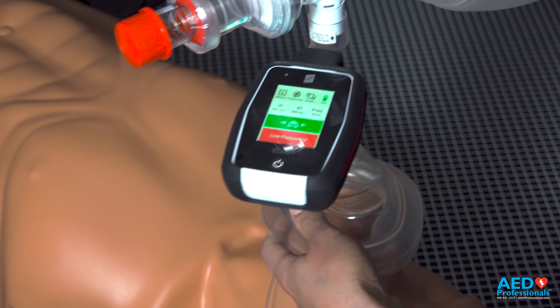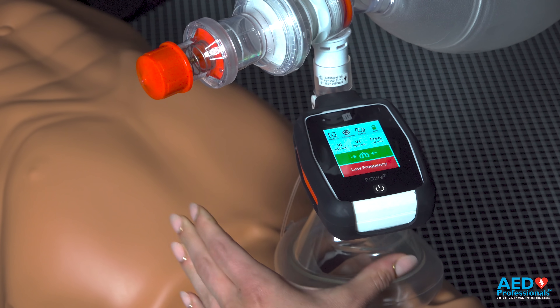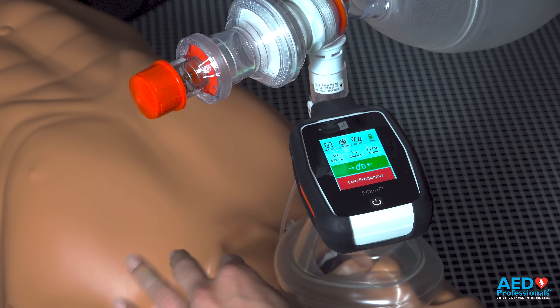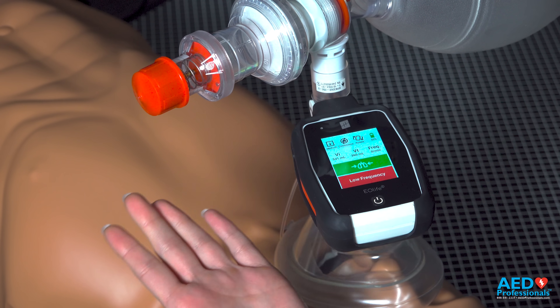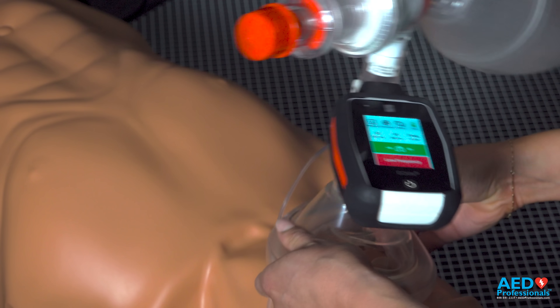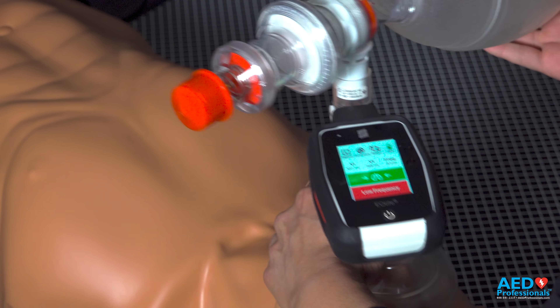First we're going to put our mask on our mannequin. The way that we've been doing it lately is with the C-grip, but we're going to opt for the OK grip because it allows for a more even pressure on the mask, especially for somebody like me that has a smaller hand. Three fingers under the chin for a lift.